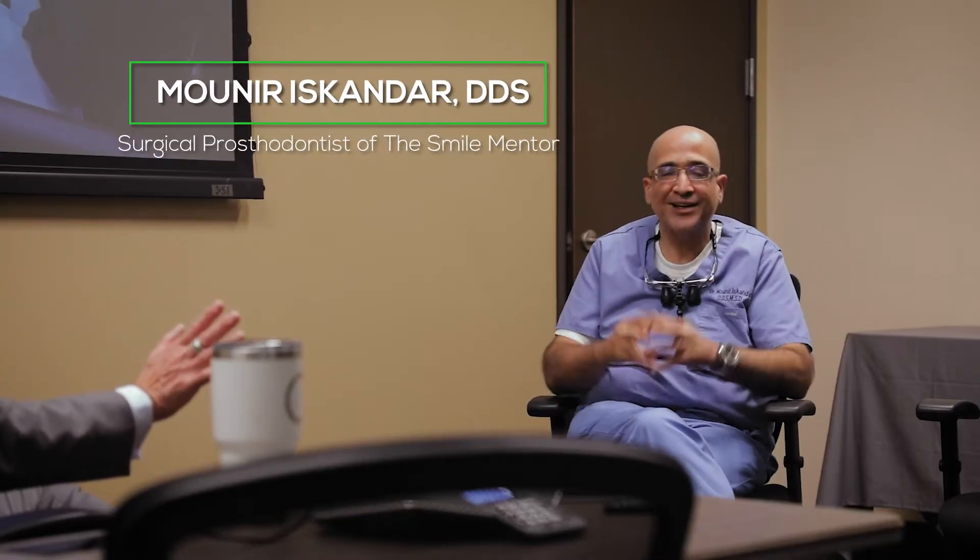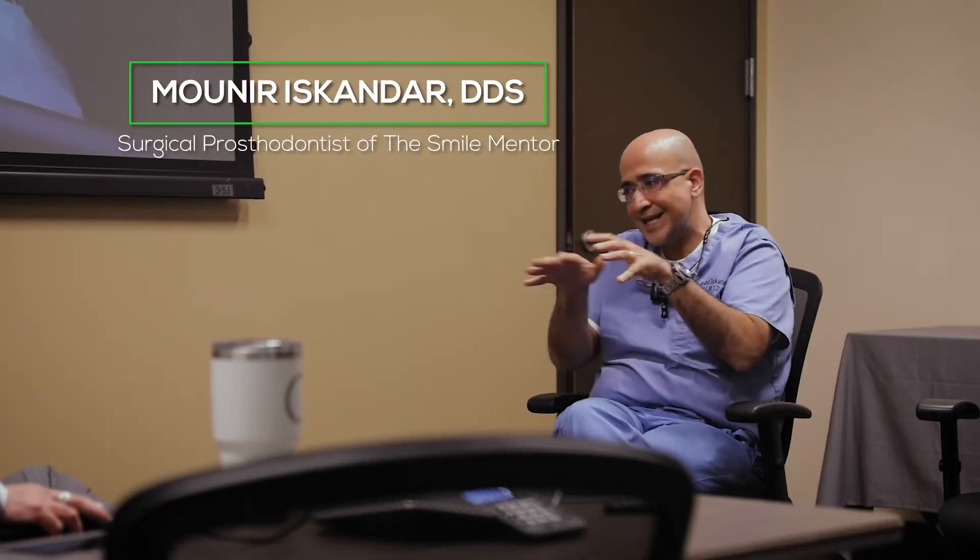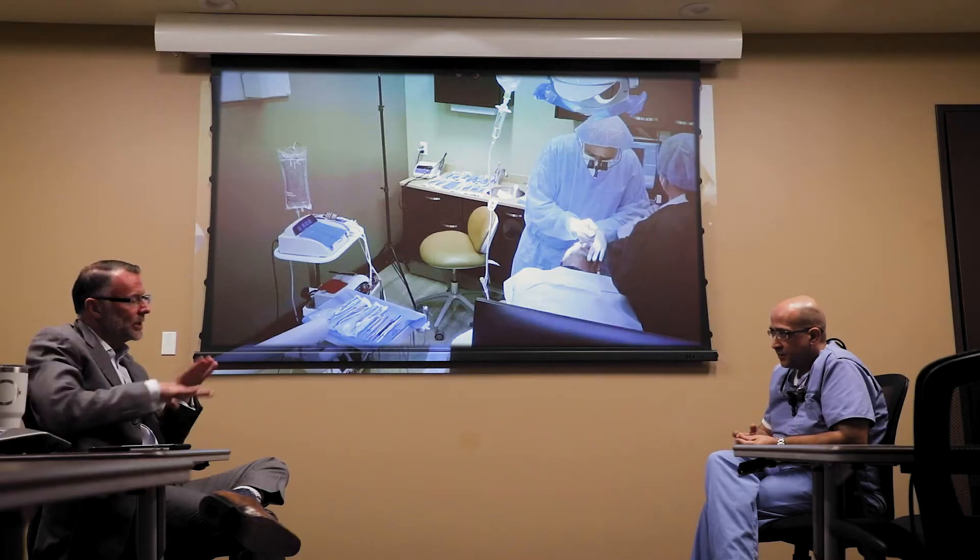So now you've taken the teeth out, you're prepping the bone to be ready for the implants. You've got to make sure the bone is clean — you have to do some bone reduction, which is leveling. It depends on so many factors, but it has to be leveled regardless of how much reduction you have, because you need a good firm foundation for the prosthesis.